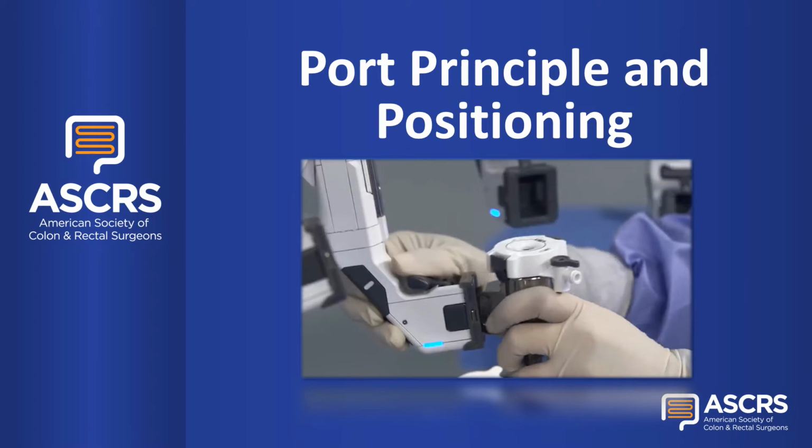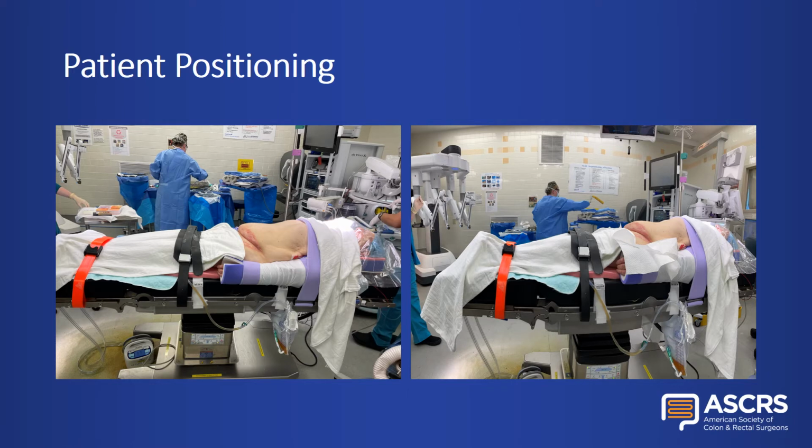Port principles and positioning. We will start with patient positioning. Patients should be placed in supine or modified lithotomy position depending on the operation.